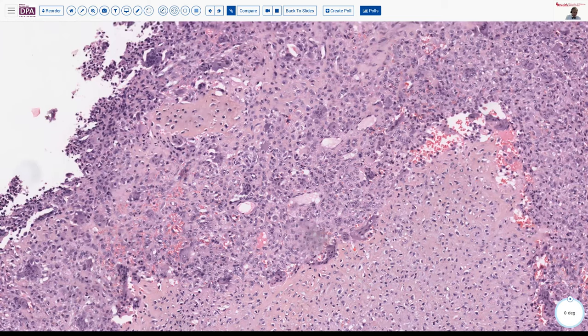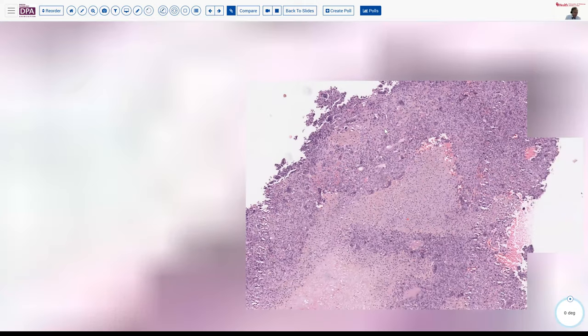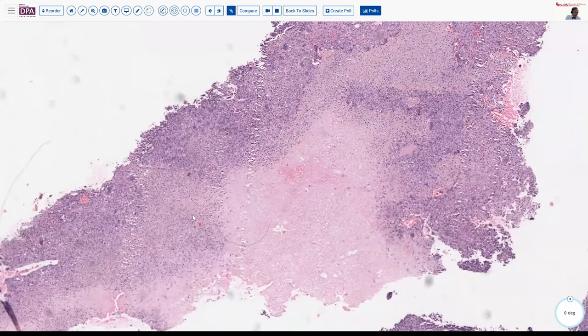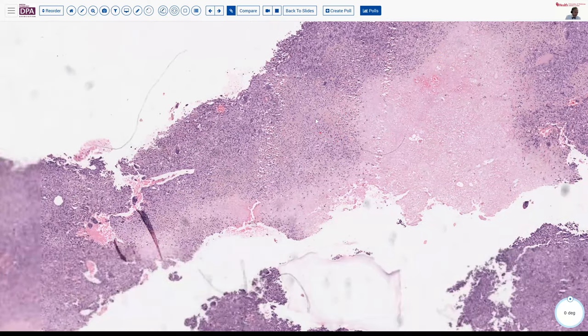Some areas of more slightly immature cartilaginous tissue with a cellular, more blastic surrounding tissue associated with it. Now, sometimes you can get necrosis, as we've indicated. Sometimes you can get calcification in these lesions, particularly in the nearly necrotic area, that seems to be little rims of calcification around the nuclei, so-called chicken wire calcification.